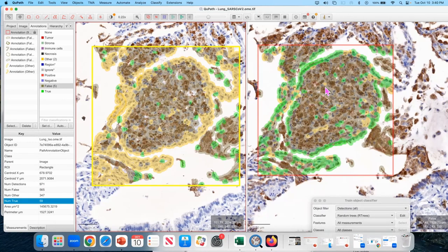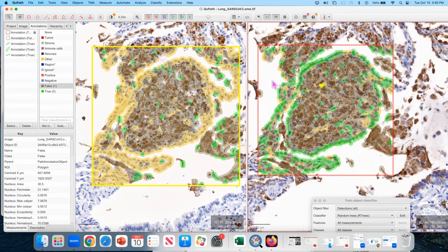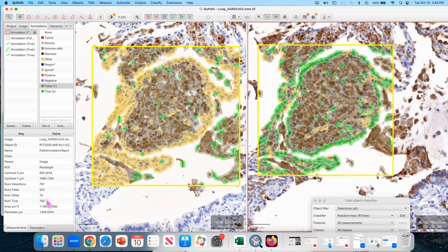But on the other hand, on this one, we are getting quite a bit more of those true detections. And if we were only using standard positive cell detection, for example, or trying to set a threshold on that, we would get a lot more false positives.